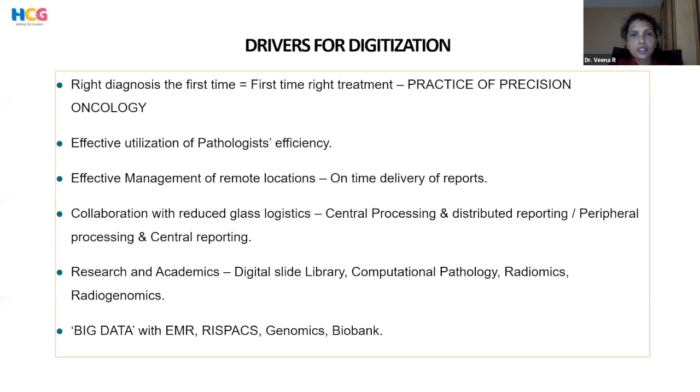And utilization of pathology services, and then remote locations, providing the reports on time, providing the same accuracy of reports within a short turnaround time, and then reducing the glass logistics, and then research and academics.